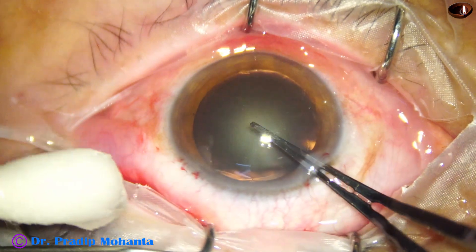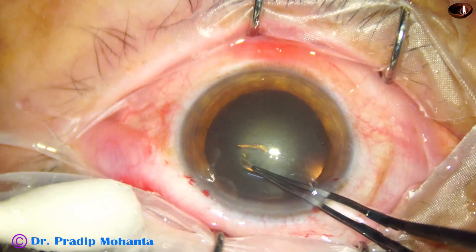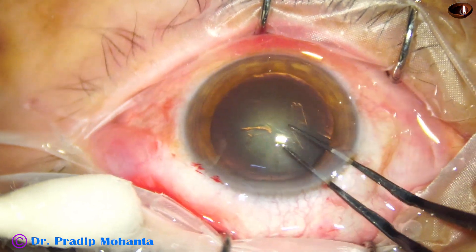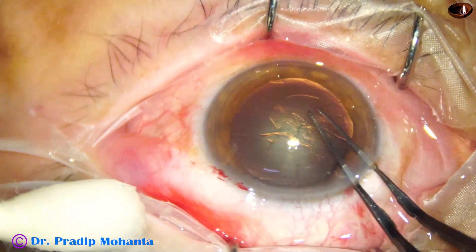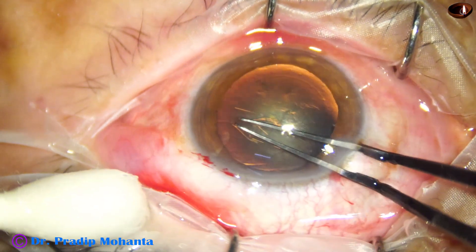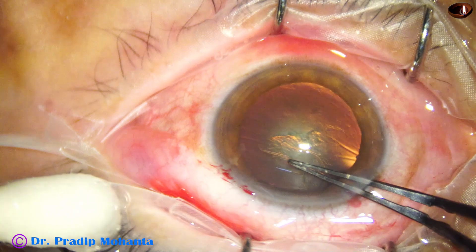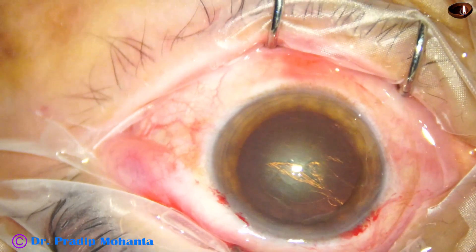Capsulorhexis is done with the help of utrata forceps. Size of the rhexis is about 5.25 millimeter. Now let us see how we can do hydrodissection and hydrodelineation.